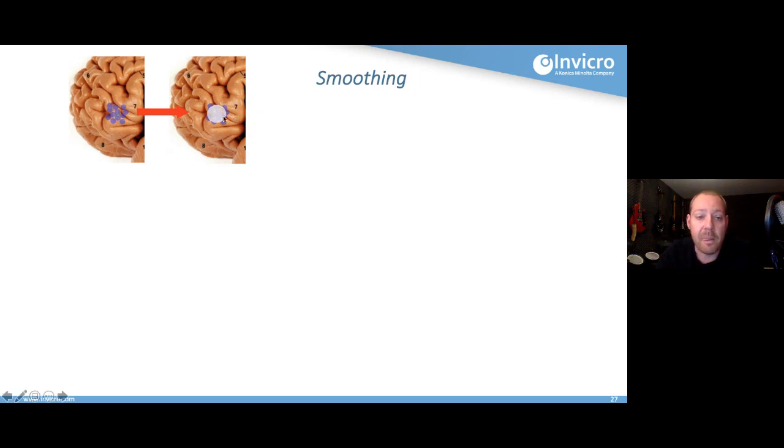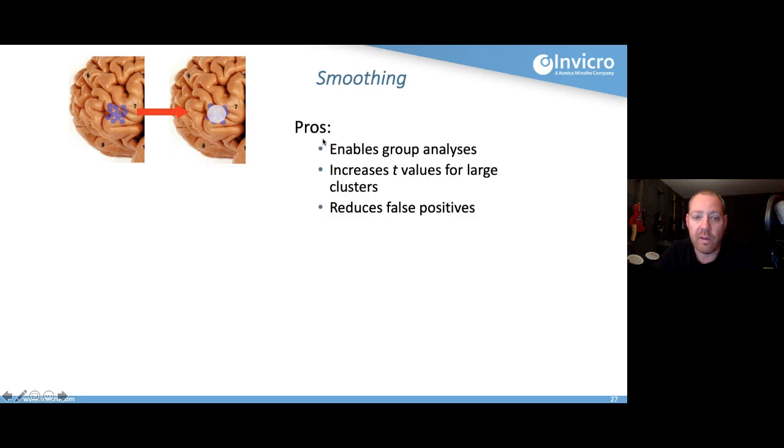to basically just remove those small spatial scales and smooth over any of those differences a bit like that. And you end up with a larger, hopefully significant activation blob in all of your 10 subjects, which gives you a rough idea of the mean, if you like, of all of their individual activation loci.